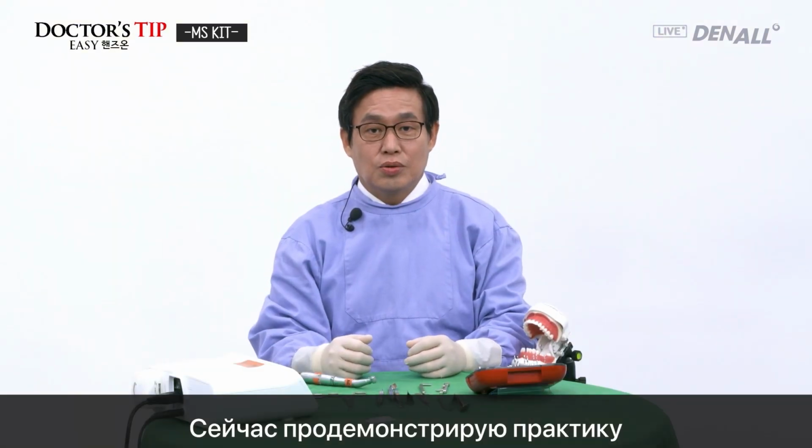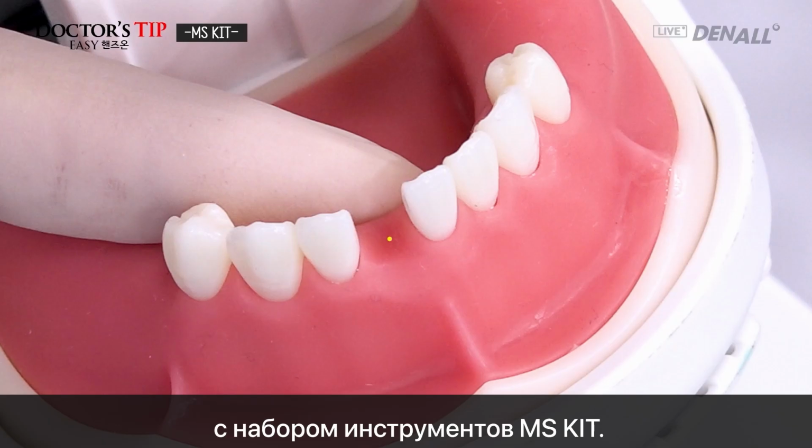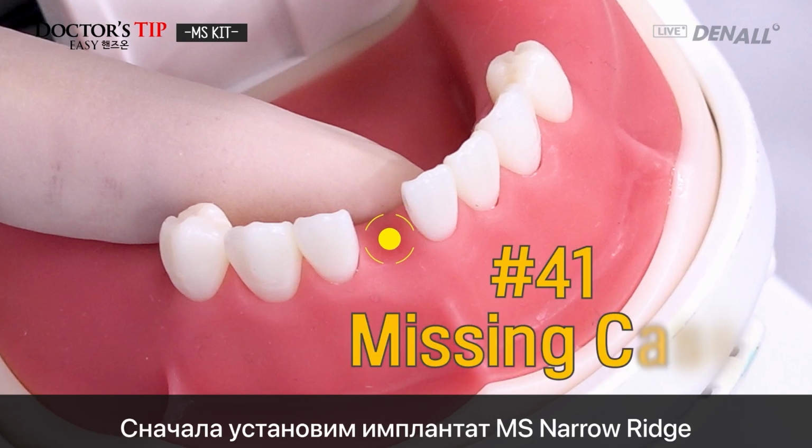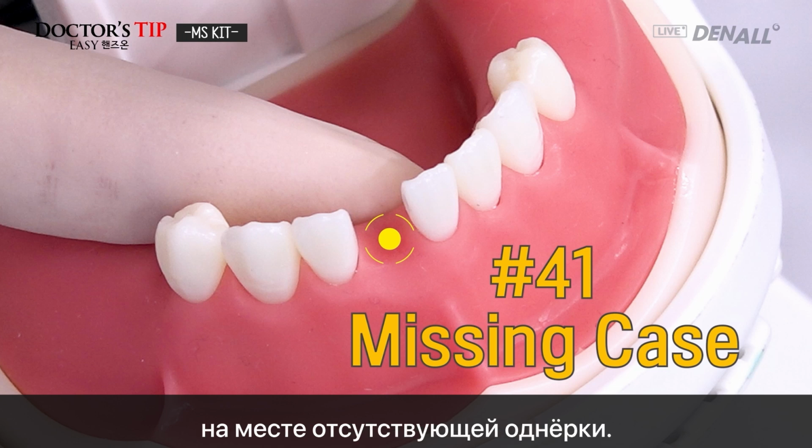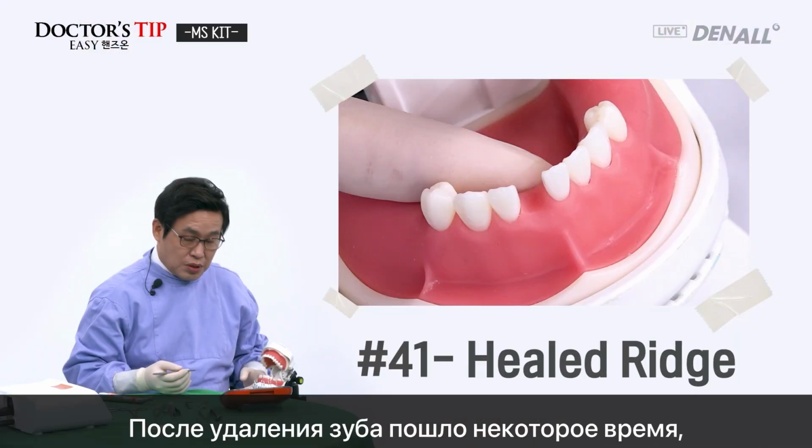So now I'll do hands-on for the MS Kit. 41 is missing, and the 2.5, length 11 millimeter MS will be placed first in the missing area.